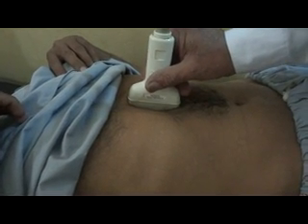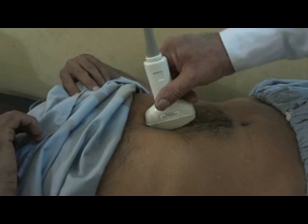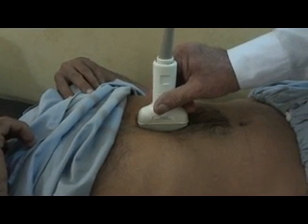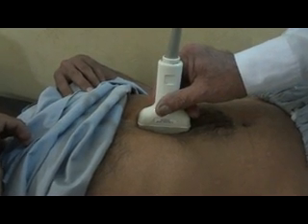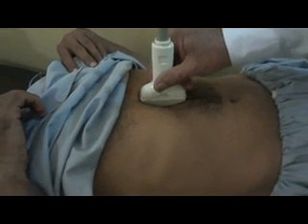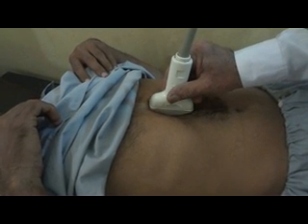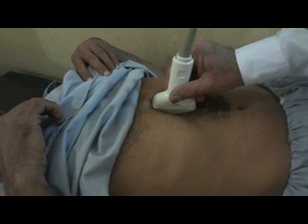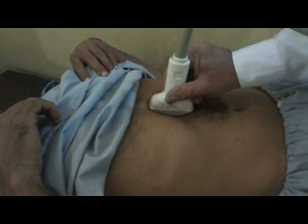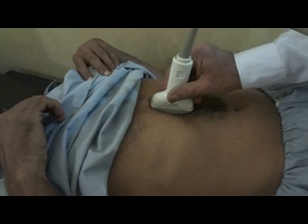So we are talking about the tail of the pancreas. Remember, it ends very close to the left kidney. For that, just now see the scanning plan. At times you will get it very easily, but at times you have to wait and maneuver the probe in a way that you can get your desired view.